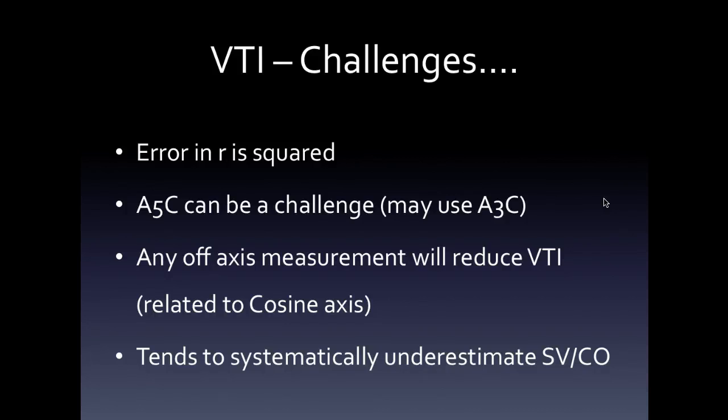And that's before you take into account that, of course, the stroke volume is going to vary with filling. And filling will vary on loading conditions, and loading conditions will vary on ventilation, positive pressure, all the issues that go on in the sick patient. So a lot of these were validated in healthy people in a core physiology lab, and unfortunately a lot of these assumptions fall down in the sick patient, which is the patient we're interested in by and large.